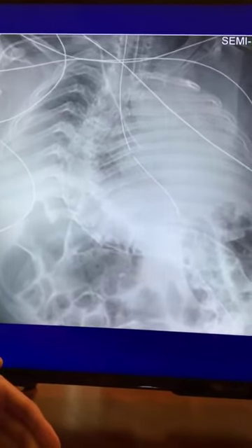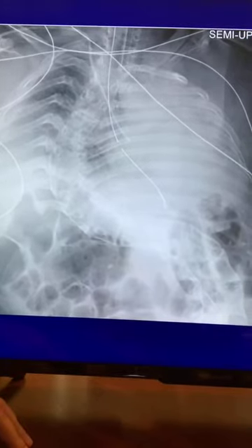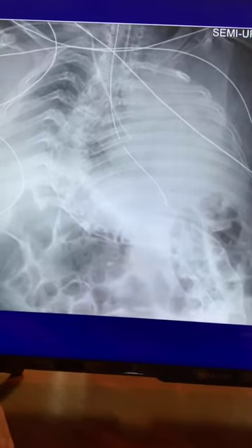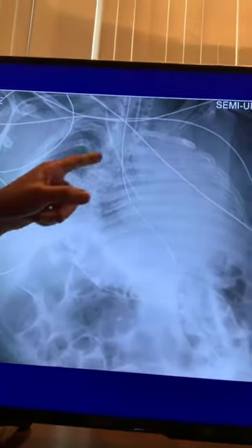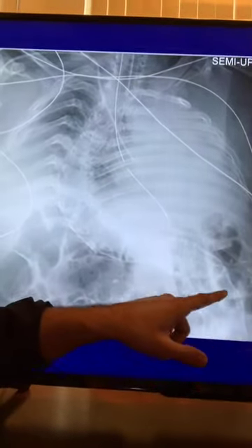Posted this one. So right off the bat, what is the most prominent thing about this chest radiograph? Anybody want to shout it out? I'll give you all a couple of seconds. I have a feeling somebody's going to type it and press enter. See, I knew it. Scoliosis, right? You see the prominent scoliosis. Everybody sees that. That's the number one finding. Anybody can see it. Very, very prominent.